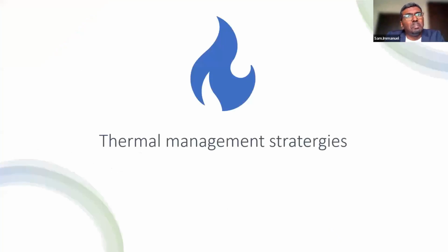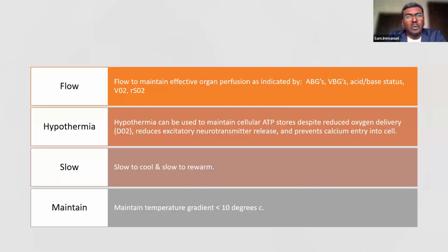Thermal management. If I ask you which is the best way to do it, there was already a presentation, the first presentation, which clearly explained it, where neurological monitoring was discussed. If I ask you which is the best mode of stat to follow, I would like to emphasize before discussing that these are the most important things which should be flashing in your mind: your flow should never be compromised, whether you are using pH stat or alpha stat. Why?